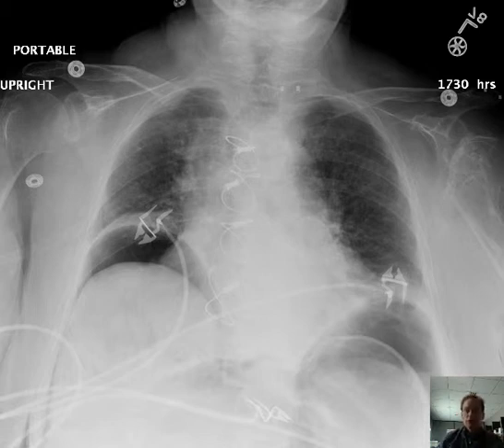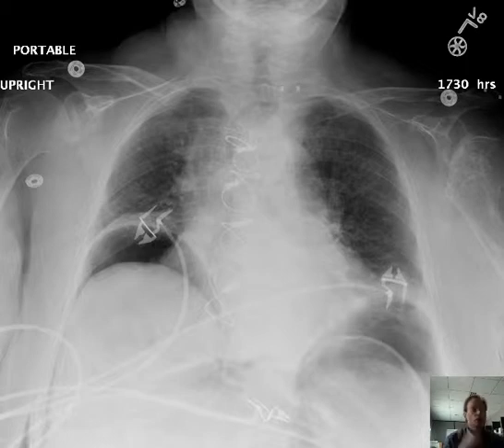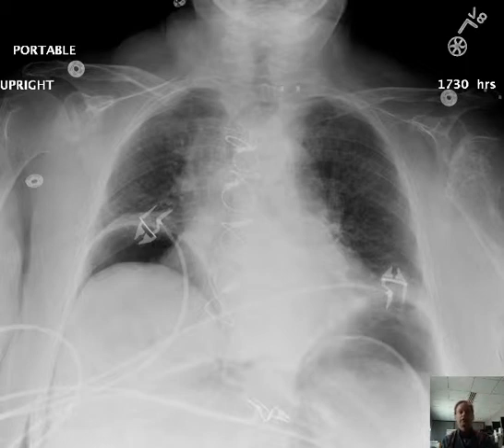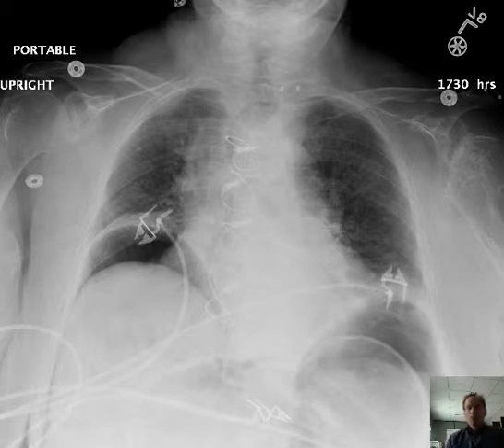Hello there, this is Dr. Mintz. This is a patient who had a colonoscopy earlier today and came in tonight with abdominal pain.